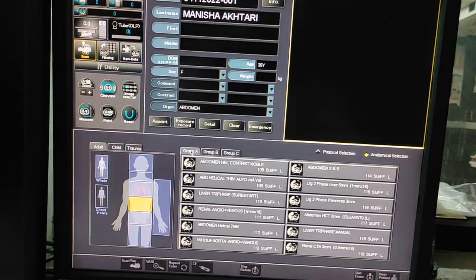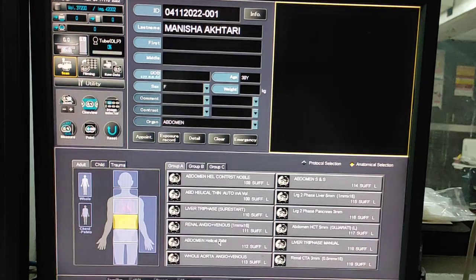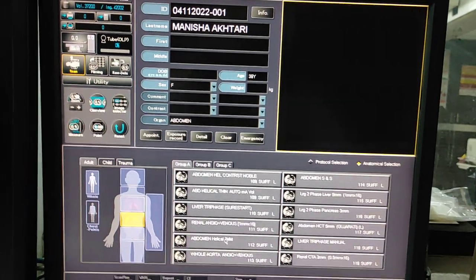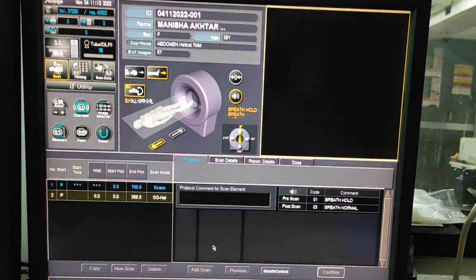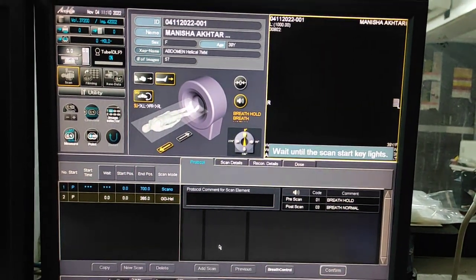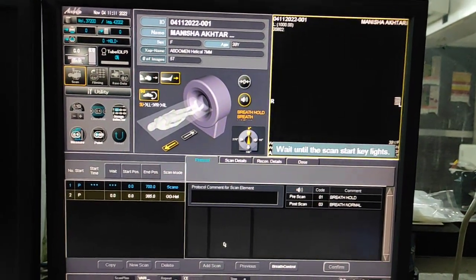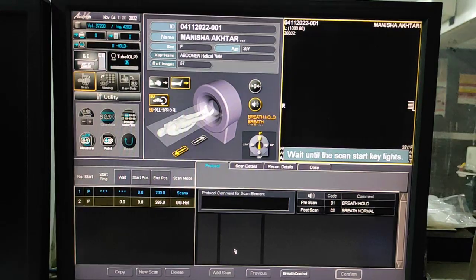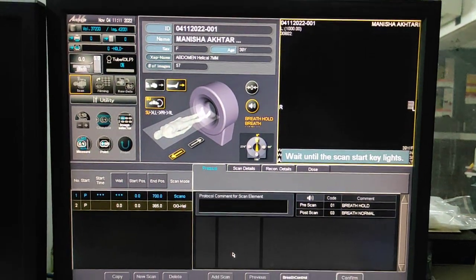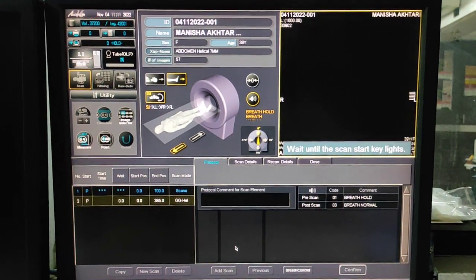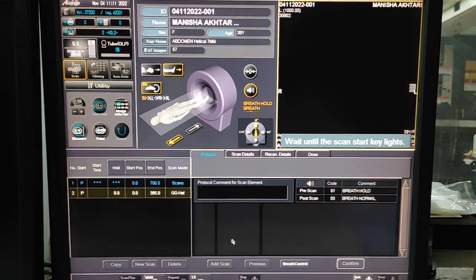I will need a long scanogram, that's why I am taking this DL spine in the abdomen protocol. You can take the scan in any protocol — you just have to give proper recons for soft tissues and for bony windows. That's it.